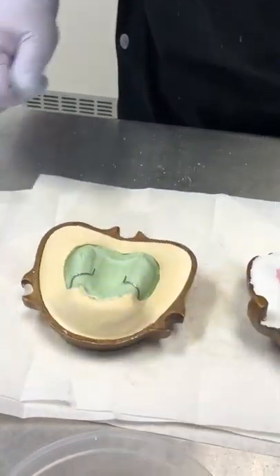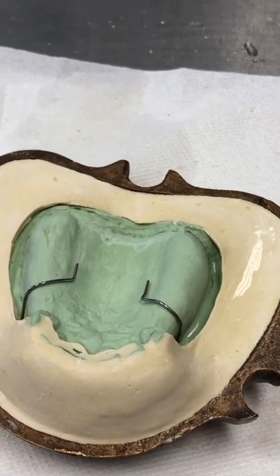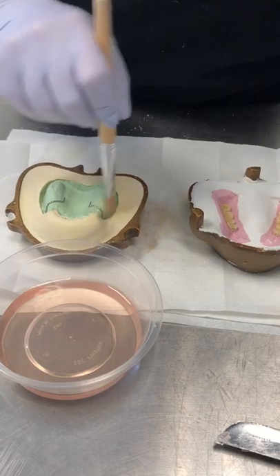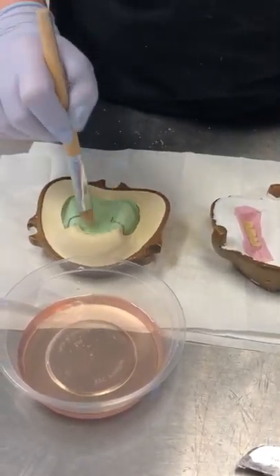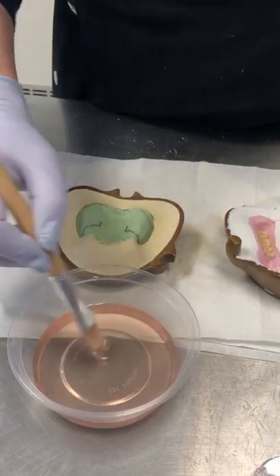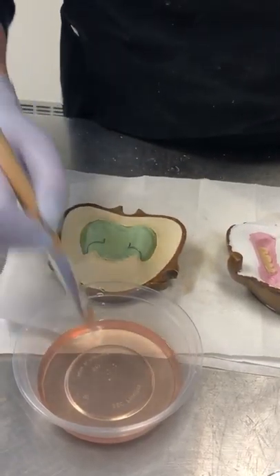It's time to separate the models. So you're just painting the separating solution on the stone, on the model, and on the investment stone as well. And this stops the acrylic from sticking to the stone.